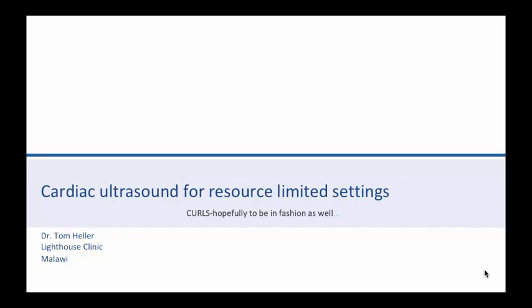This is Tom Heller again, and today we will talk about cardiac ultrasound for resource limited setting, the CURLS protocol, which will hopefully become as fashionable to you as the FASH protocol.